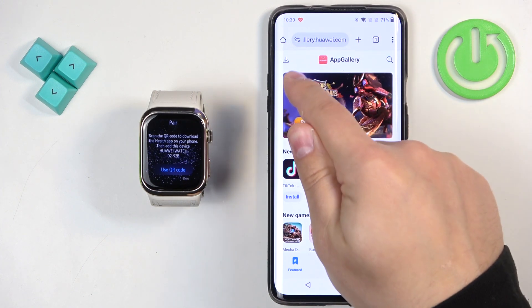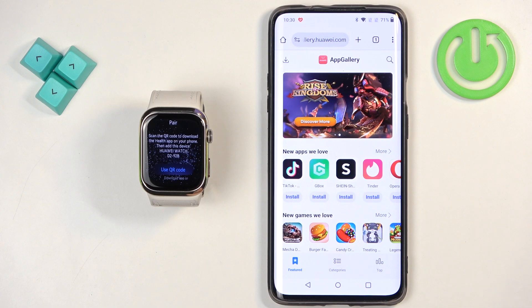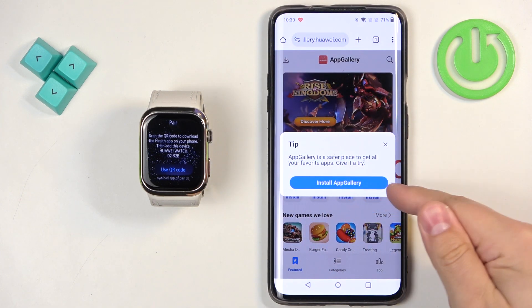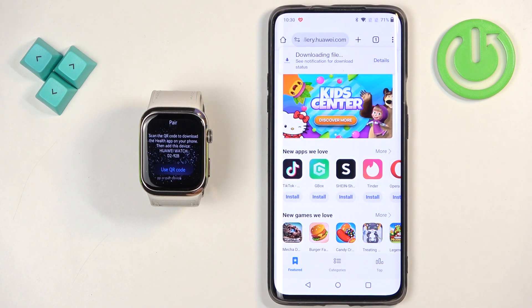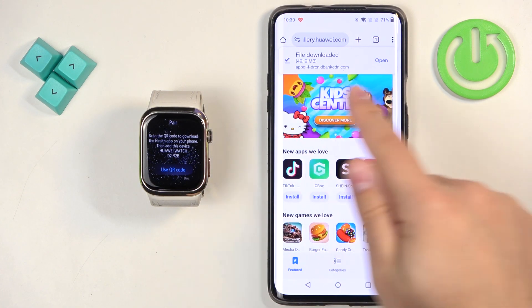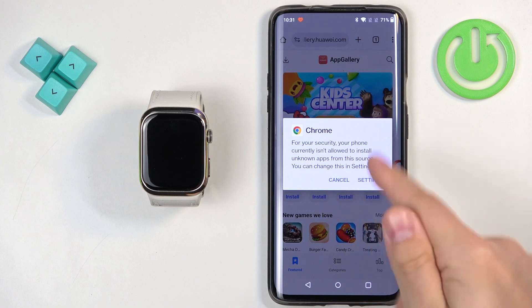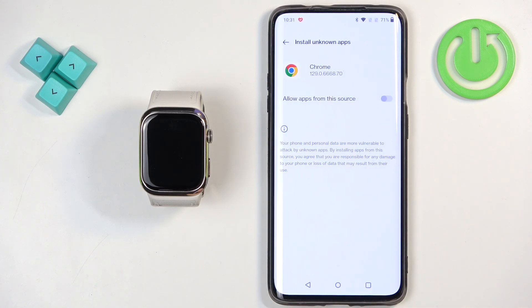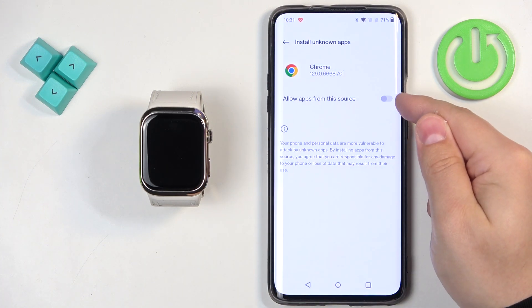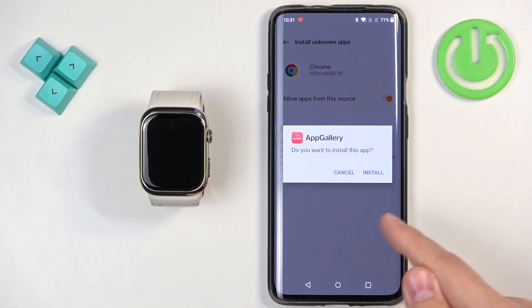On this page you have a button in the top left corner — this is the download button for the App Gallery. Tap on it, tap on install App Gallery, and it will start downloading. Once it's done downloading you will see a pop-up on the screen. Tap on open. If you don't have the required permissions allowed for Chrome to launch this application, you will see a pop-up — tap on settings and tap on the switch next to allow apps from this source.